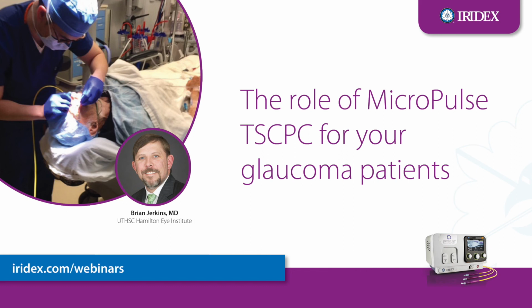Have you used any subconjunctival steroids as a postoperative regimen as opposed to drops or in combination with drops? I really haven't with this at all. And it is something I do probably about half the time on my glaucoma surgeries. I will use subconj injections. I've not used it one time that I can remember with a MicroPulse. I may have once or twice in the past with a G probe, but that was not something I utilized on a regular basis.